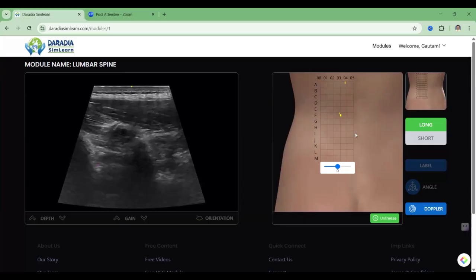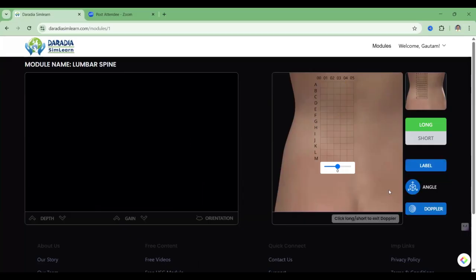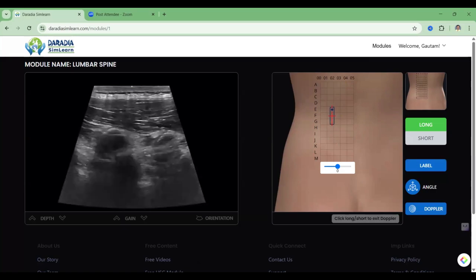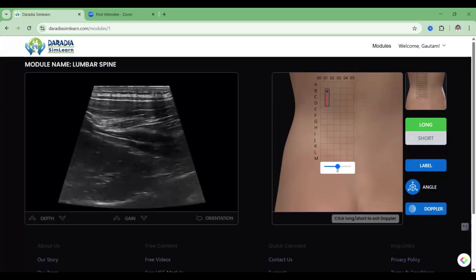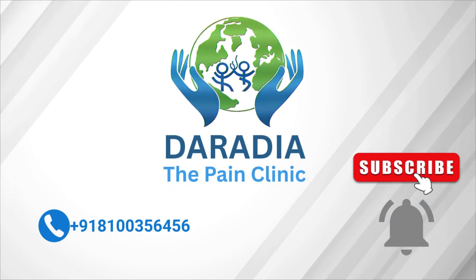We can understand that here you don't really need a volunteer, you don't really need an ultrasound machine. You have a mouse over this grid and it is getting converted into a probe. For the best experience, a touch screen with your finger is not a good option. To have a real feeling that you are holding the probe, you should have a mouse — use this with a mouse on a desktop or laptop and you'll have the best experience. Best of luck. Enjoy the ultrasound simulator. Thank you.